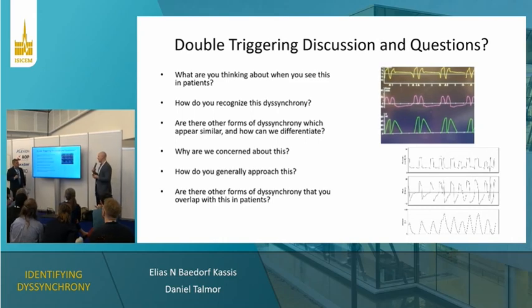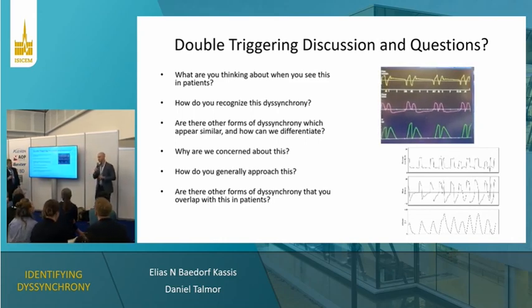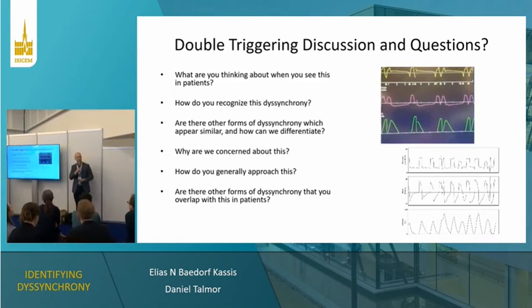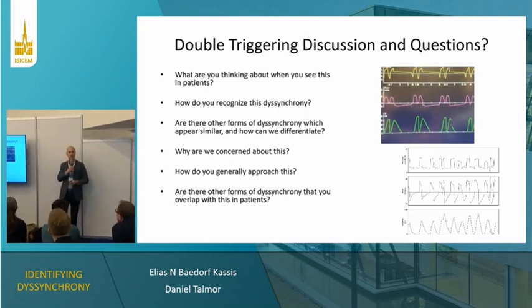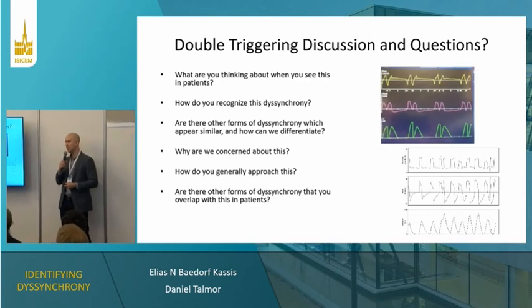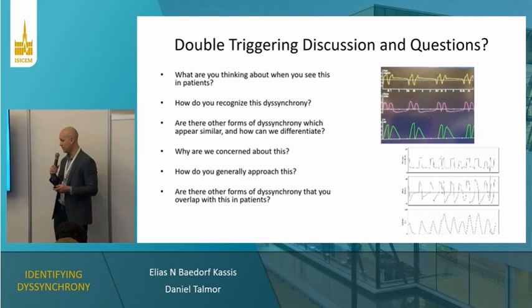Yep. And then this was already kind of discussed by this gentleman in the front here, but this is one of these forms of dyssynchrony that oftentimes you see in combination with other forms of dyssynchrony, which we'll talk about in a little bit as well. These sort of high drive dyssynchrony states, these flow starvation states, okay?